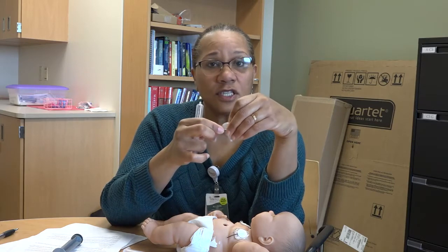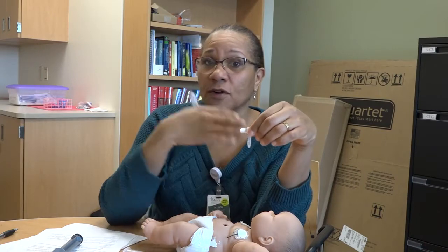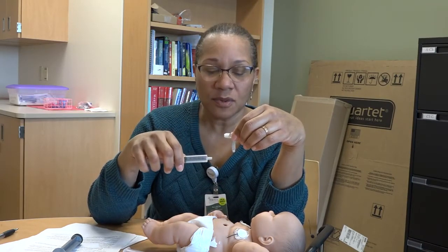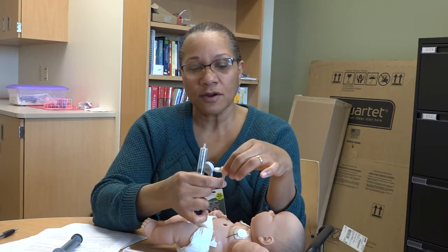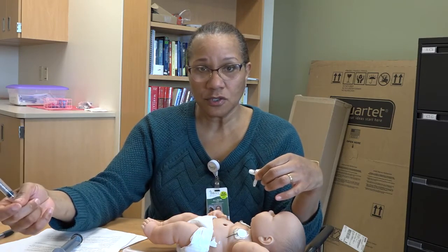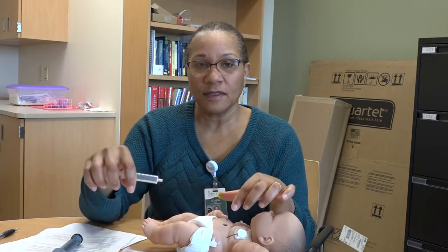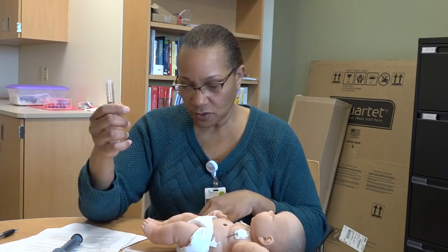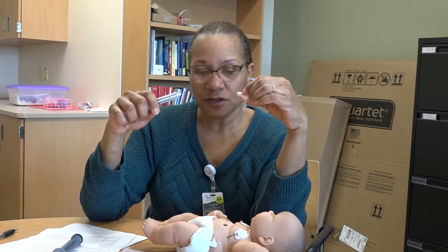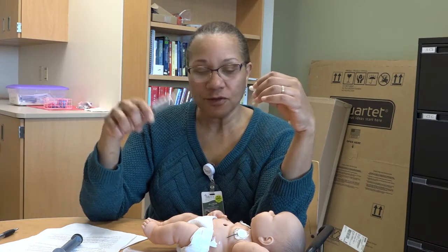And when we change the G-tube, it is not a surgical procedure. And since you would have already seen that G-tube change one time, then you know that it's as simple as taking all of the water out of the retention balloon and then getting your new G-tube, placing it inside of the stoma area, and then refilling it with water.